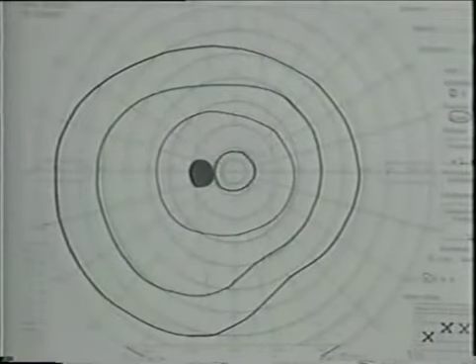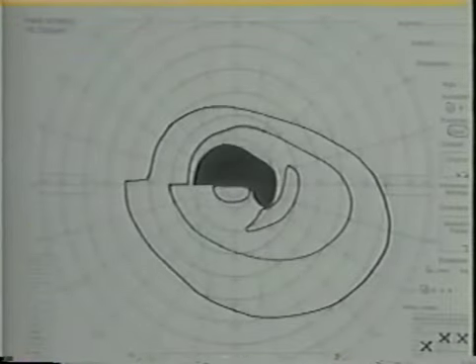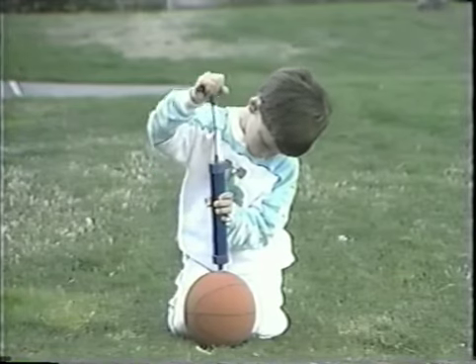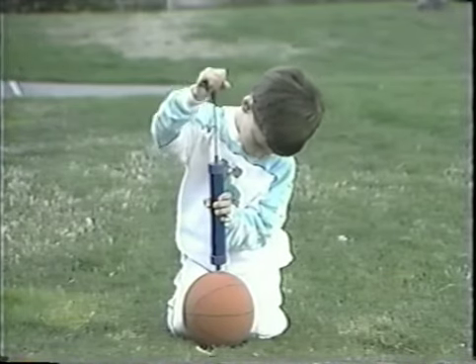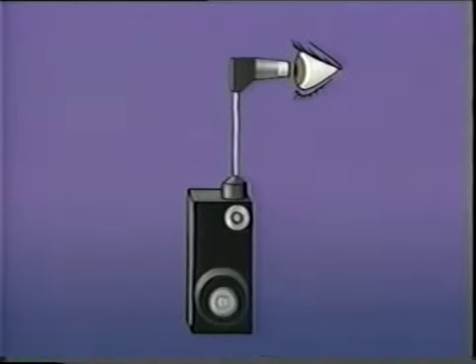A patient with elevated intraocular pressure but no damage to the visual field or optic nerve is considered a glaucoma suspect or ocular hypertensive. If damage in the nerve or visual field is detected, a diagnosis of glaucoma is made. There are a variety of familiar ways to measure the pressure of an object, such as by palpation or by inserting a manometer or gauge. Since this cannot be done in a human eye, indirect methods of tonometry are used.